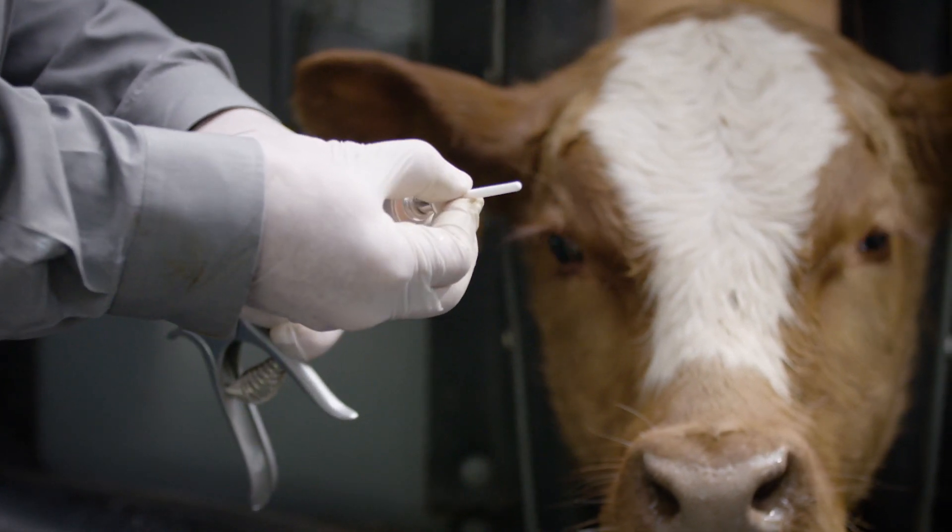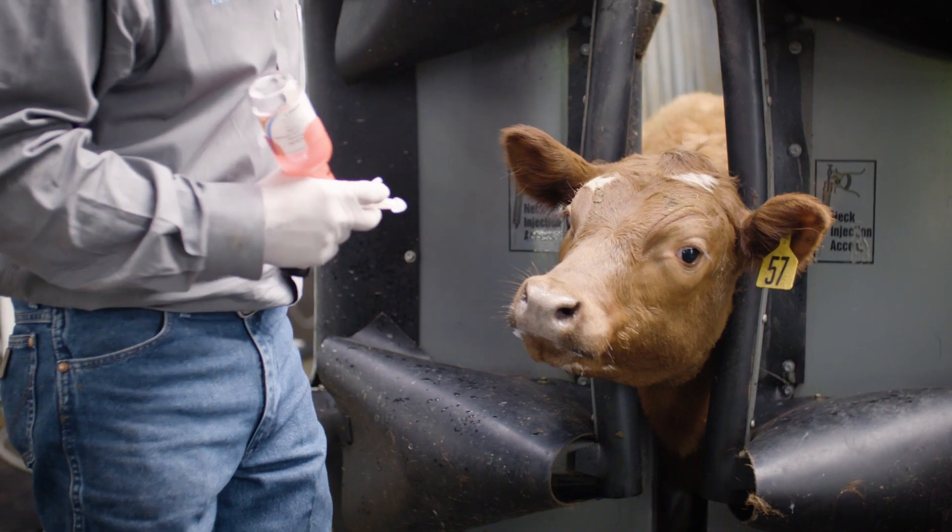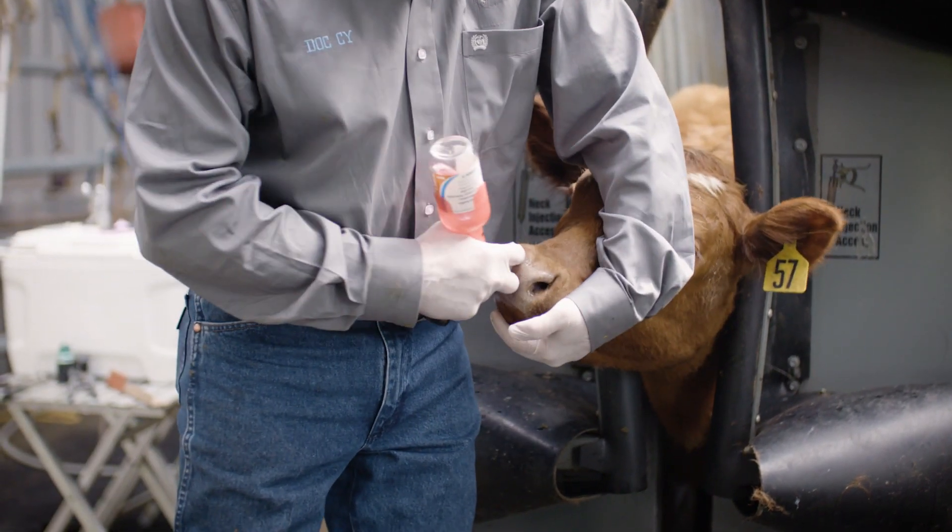Be sure to use a new cannula for each animal to prevent the spread of pathogens. Make sure to grasp the cannula only by the collar when removing. On the pump-it device, use a clean paper towel to wipe the tip clean between calves.